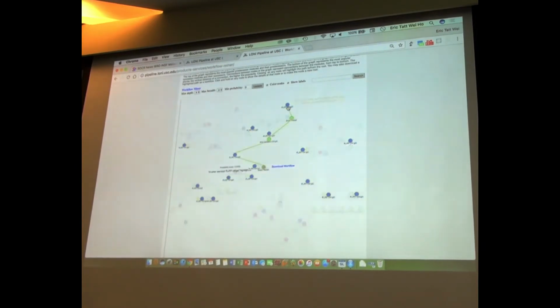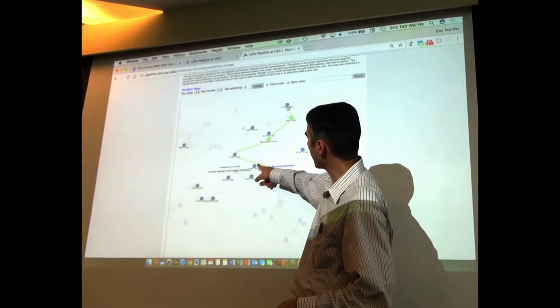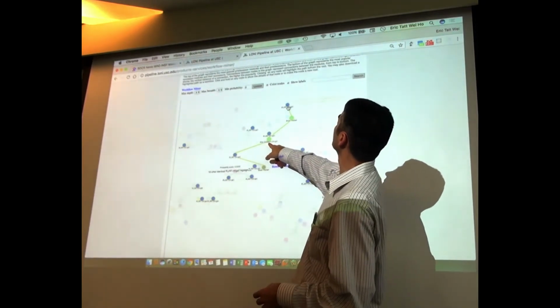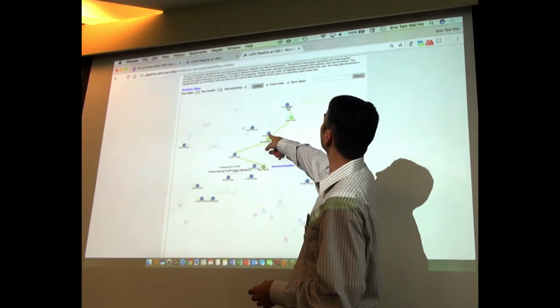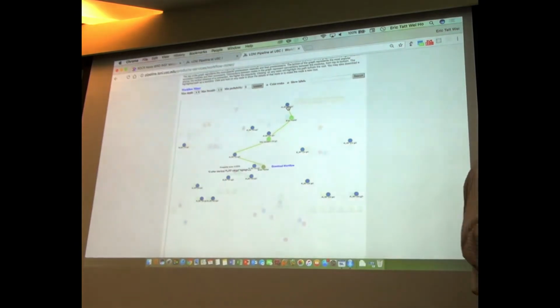So I can select a branch, and it tells me, well, you can download this workflow: brain parser, flirt, FSL, some process, flirt, I can't read it, something else. So this is a workflow that does something that relates to segmentation.